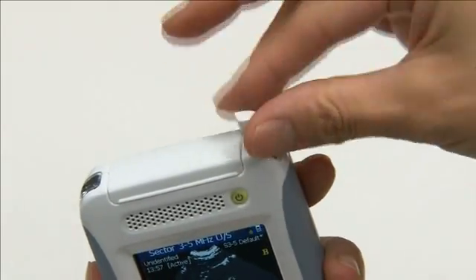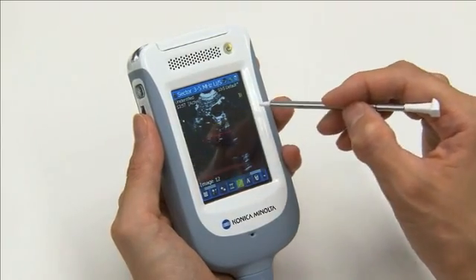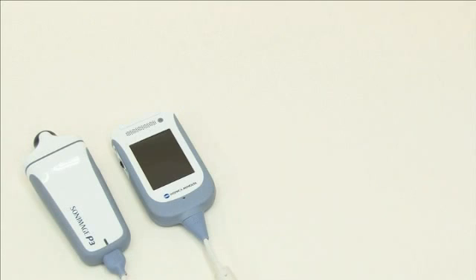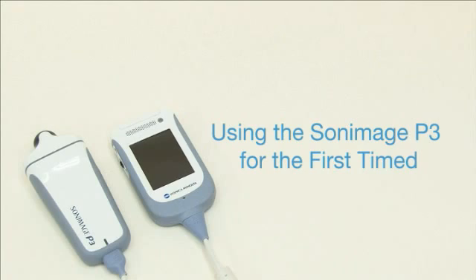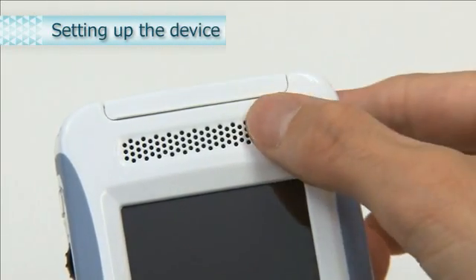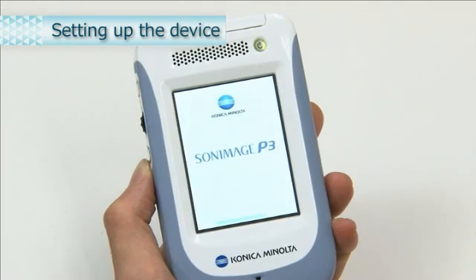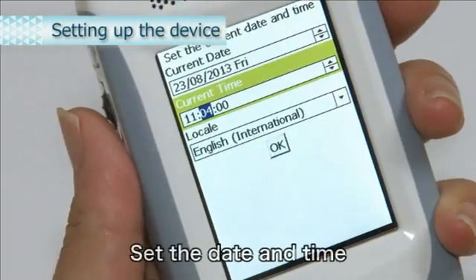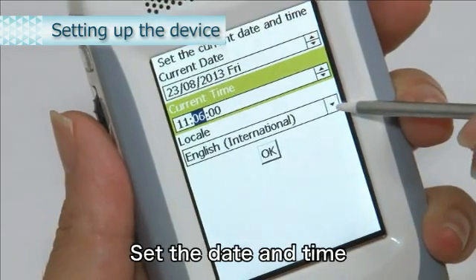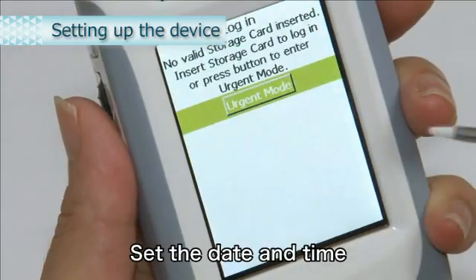The back button is used to go back to the previous screen and to switch modes. The stylus pen can be used to operate the screen. Before using the SONIMAGE P3, perform device setup. Press the power button to start. Use the stylus pen to enter the information. When you have finished, select OK. This completes the device setup.